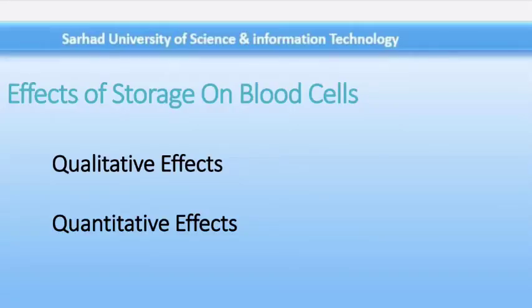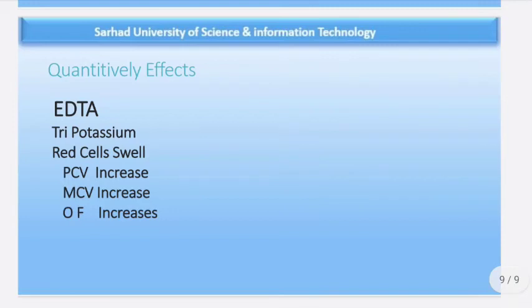Other changes take place when blood is allowed to stand in vitro at room temperature, around 18 to 25 degrees centigrade, or more rapidly at higher ambient temperatures. The most important anticoagulant used is EDTA, which has a greater effect as the tri-potassium salt than as the di-potassium salt. Red cells start swelling, resulting in increases in PCV and MCV. Osmotic fragility slowly increases and the sedimentation rate decreases. Leukocyte and platelet counts gradually fall.